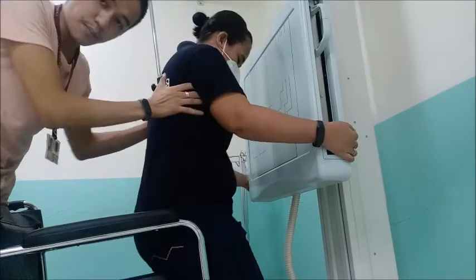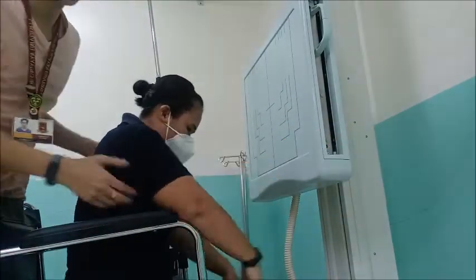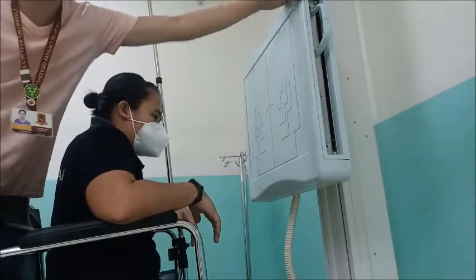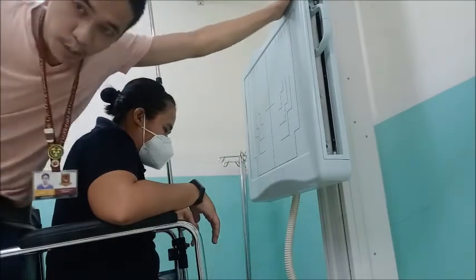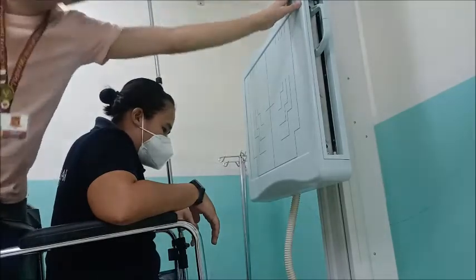So pagpalingkod ng patient, also you have to assist the patient. And then of course you have to also instruct the patient na maghawit siya. Okay, so this is a very sturdy nga equipment. Pwede hawiran ni patient pagtindog niya, and then also paglingkod niya sa wheelchair, pwede niya hawit.